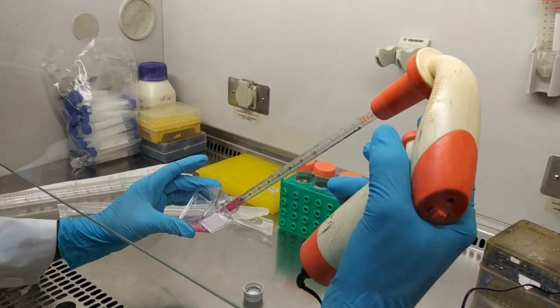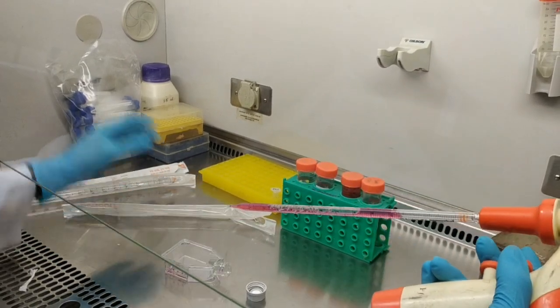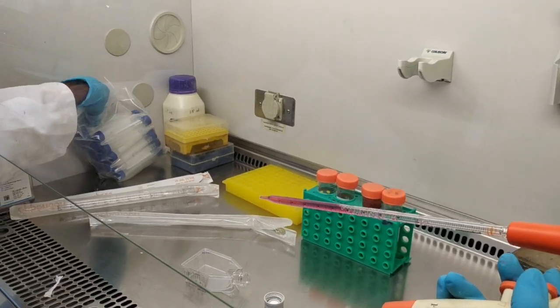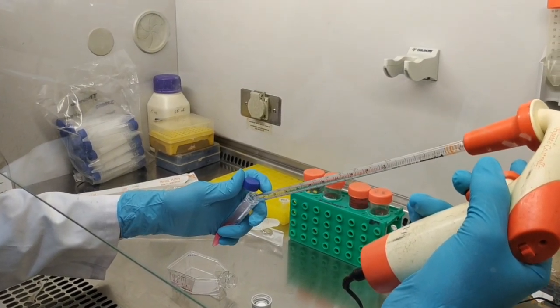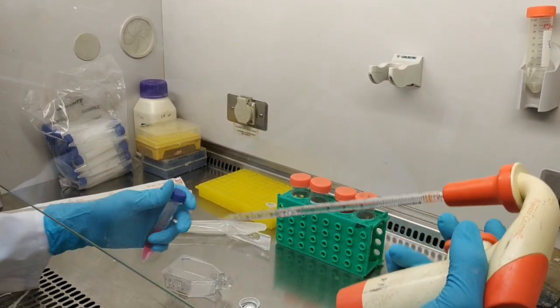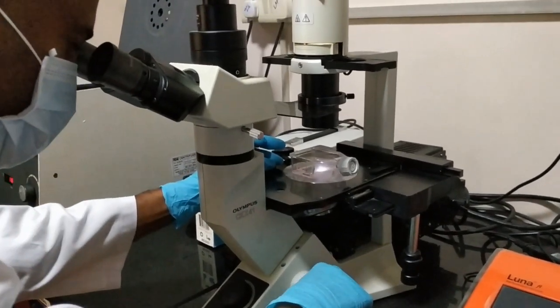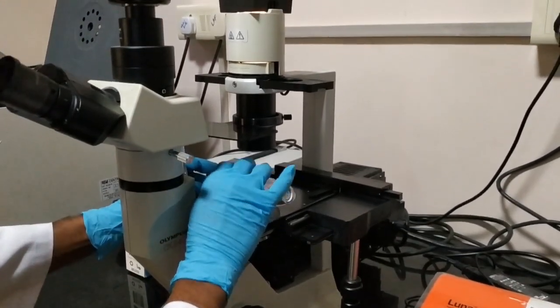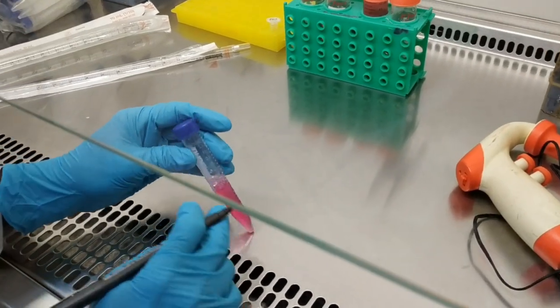After the collection of cells, you need to collect them into the centrifuge tubes. So I'm taking the entire cells and also the trypsin containing medium. You can observe under the microscope whether any cells were left over in the culture vessels, to make sure that we collected the entire cells, and then label properly.